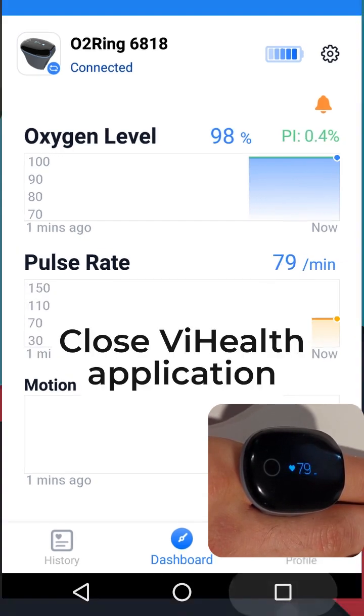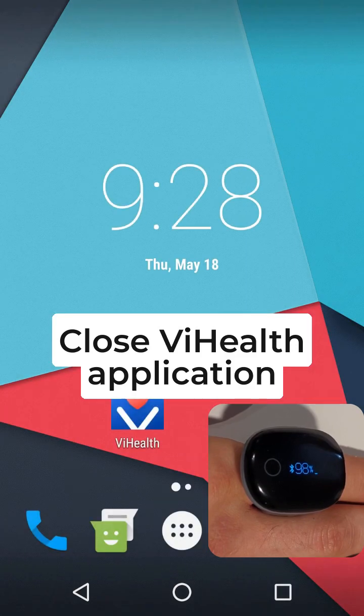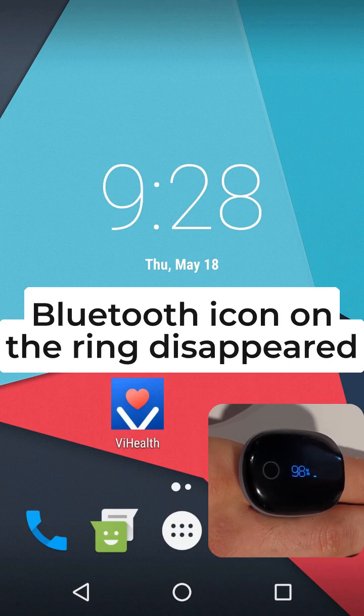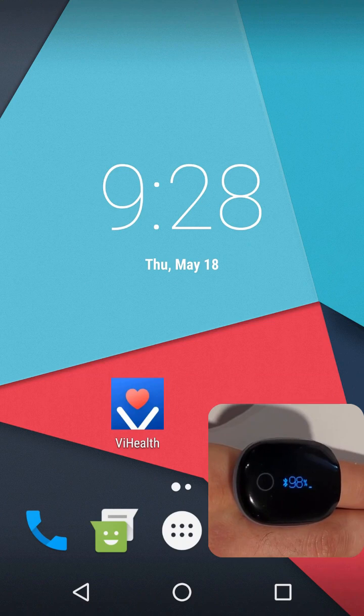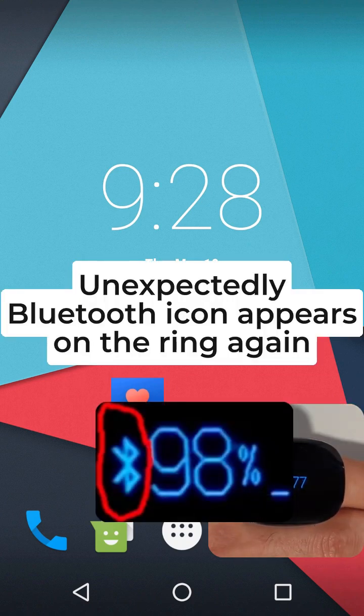Close the Vi Health application. The Bluetooth icon on the ring disappears. Then, unexpectedly, the Bluetooth icon appears on the ring again.